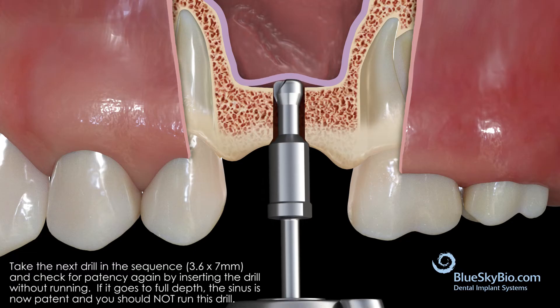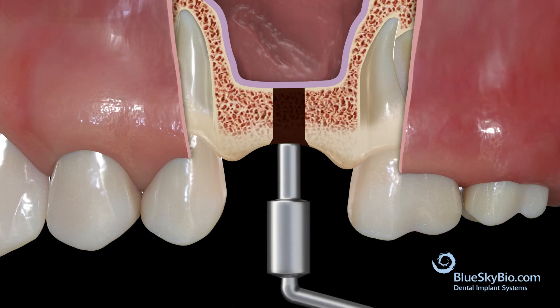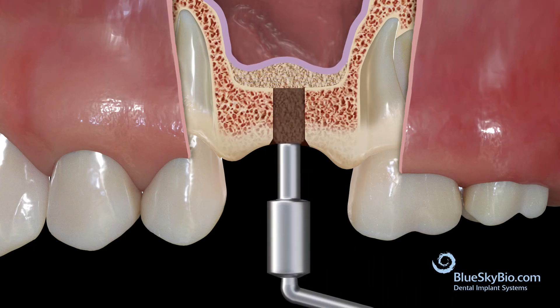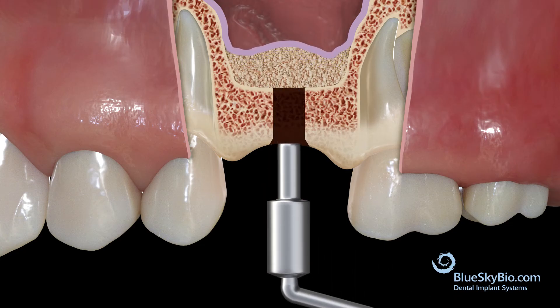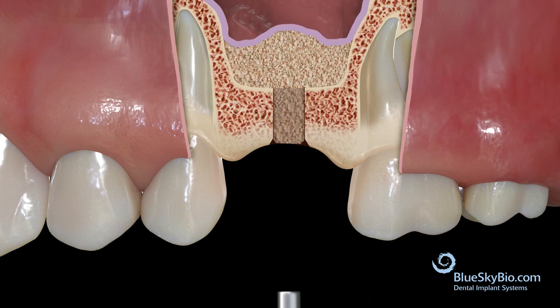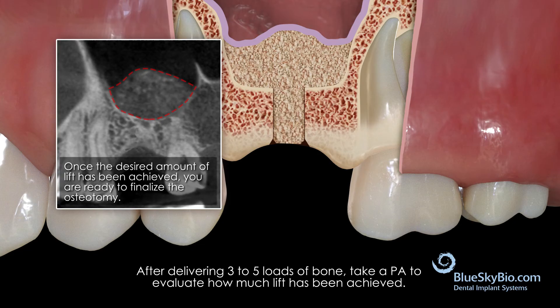You can now begin lifting the membrane. Since patency was achieved with the 6 millimeter long drill, the corresponding 6 millimeter long graft packer should be used to condense the graft. Use a gentle wobbling motion to condense the graft until the depth stop on the condenser bottoms out on the crestal bone. Continue loading and condensing graft material into the osteotomy. After placing three to five loads of graft material, a periapical x-ray should be taken to evaluate how much lift has been achieved. There should be a well-maintained dome of graft material visible above the sinus floor.